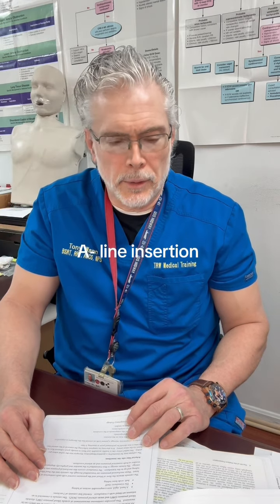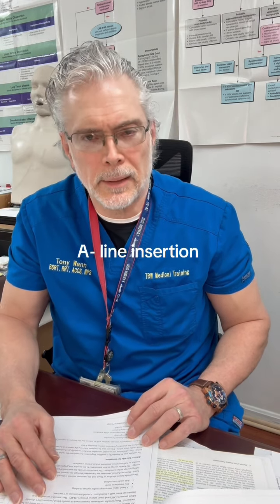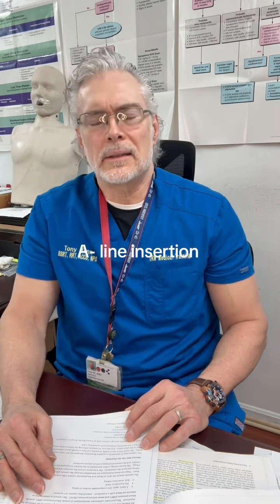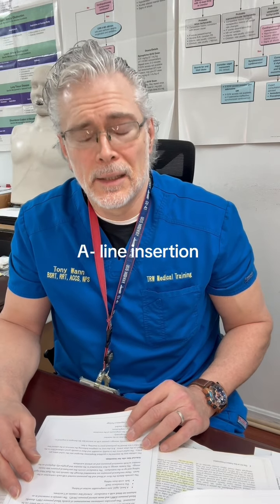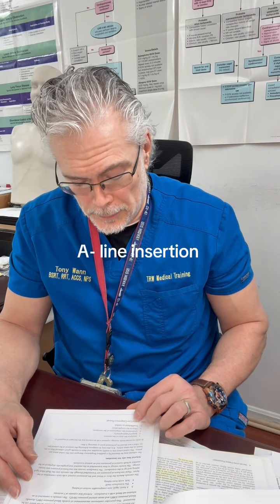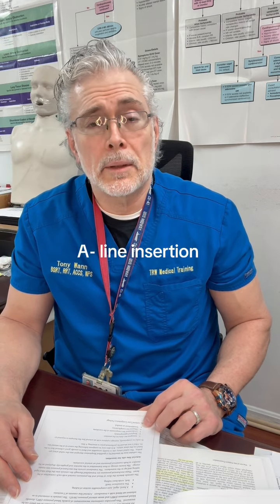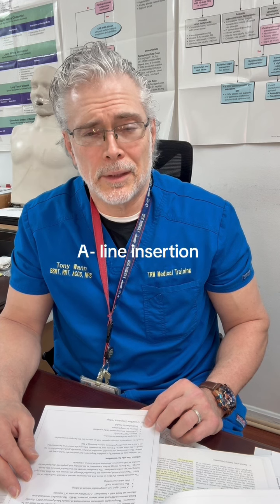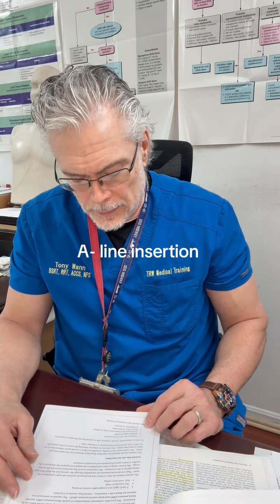The most conventional, the best place to start is going to be the radial site. We're going to discuss how to do an Allen's test, check for collateral circulation and that kind of thing. We're also going to understand the waveform, the components of the waveform of an arterial line. We'll discuss the dicrotic notch and many other things.